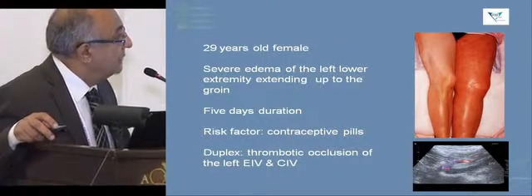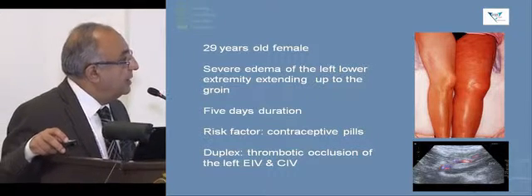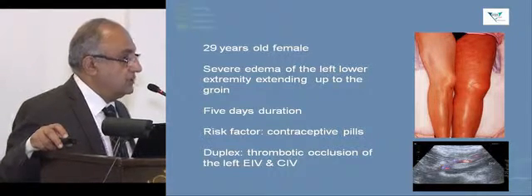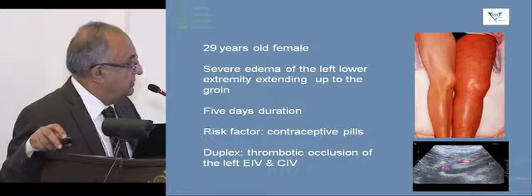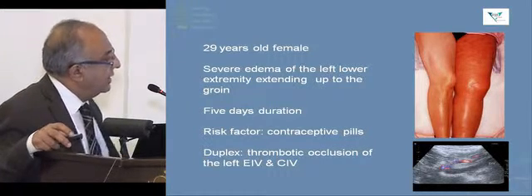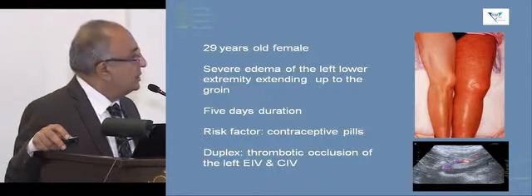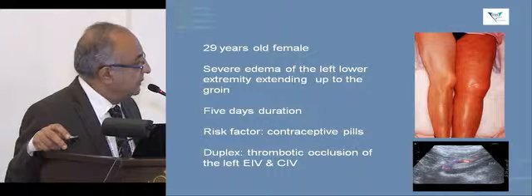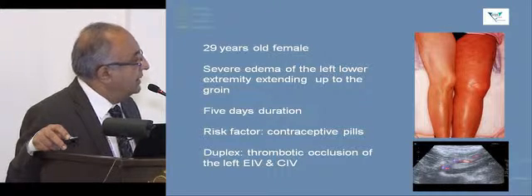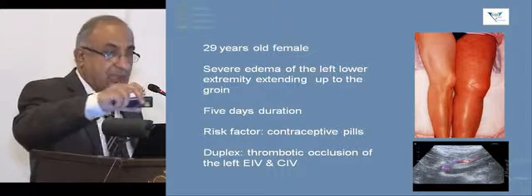A more proximal venogram shows the occlusion of the proximal common iliac vein. Those venograms were taken with the patient prone, so this is the left side. The patient was then turned over to a supine position, and direct access was obtained onto the femoral vein. And this image shows a venogram of the left external iliac and common iliac veins with total occlusion of the proximal end of the common iliac vein.